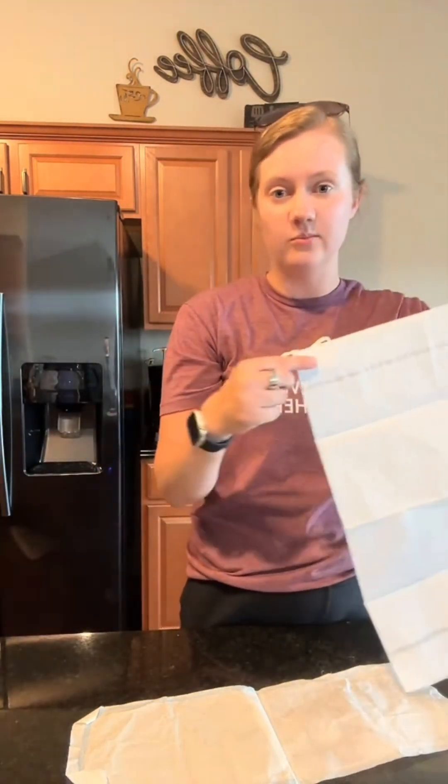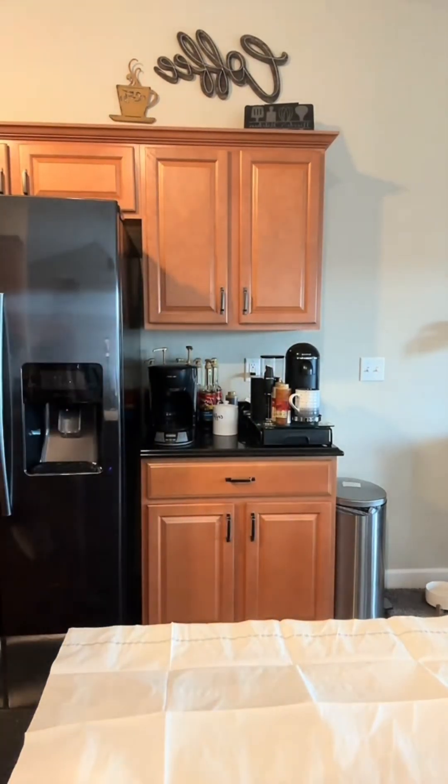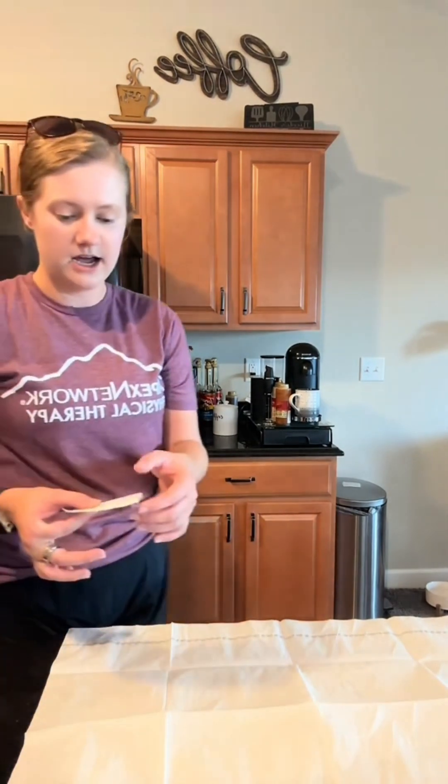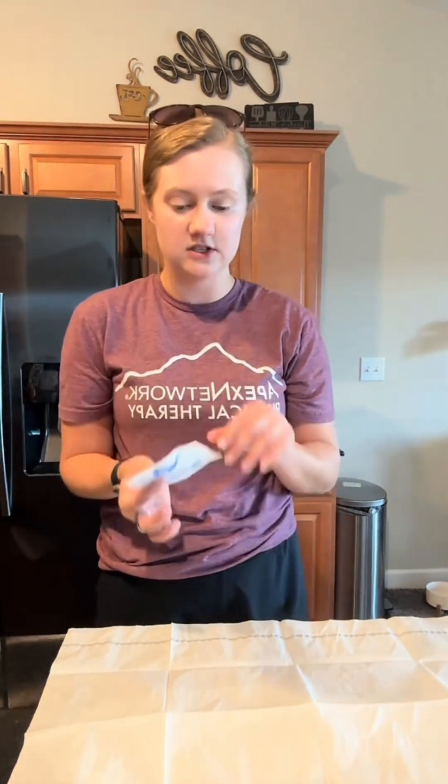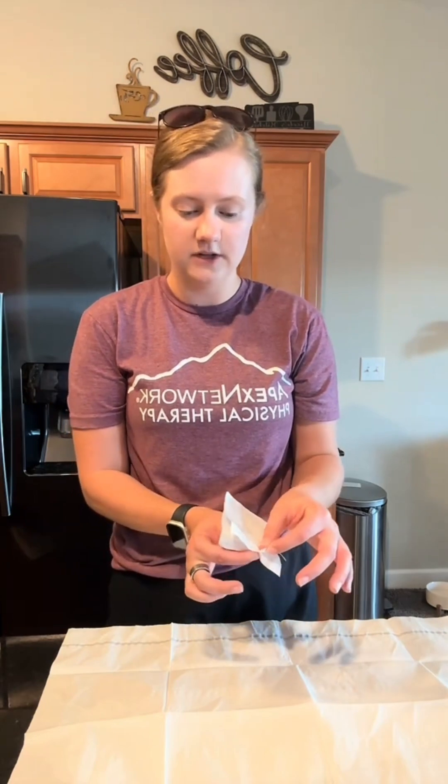I would step to the side if I had more table space, but I don't, so we're going to act like I do. We're just going to put the sterile drape down. You are not supposed to reach across your sterile drape. I need my gauze which is on the other side, so I'm going to go around, grab that, and then open the gauze without having sterile gloves on, which means we can't touch it over our sterile field.